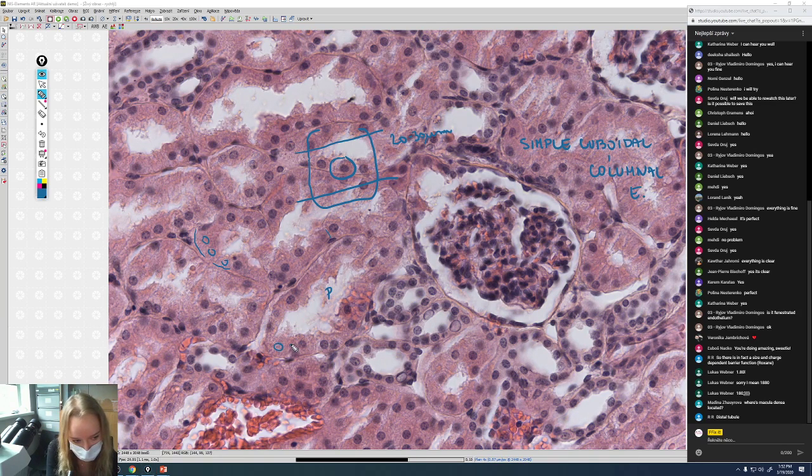You're not able to see nuclei all around the tubule. Also right here, this is a cross section. And you can really see a nucleus here, here, here, but there is a blank space and you're not able to find nuclei. So this is pretty much normal. It's a normal state. It's not that nuclei are missing, they're just not there because of the section. So don't worry about that much.